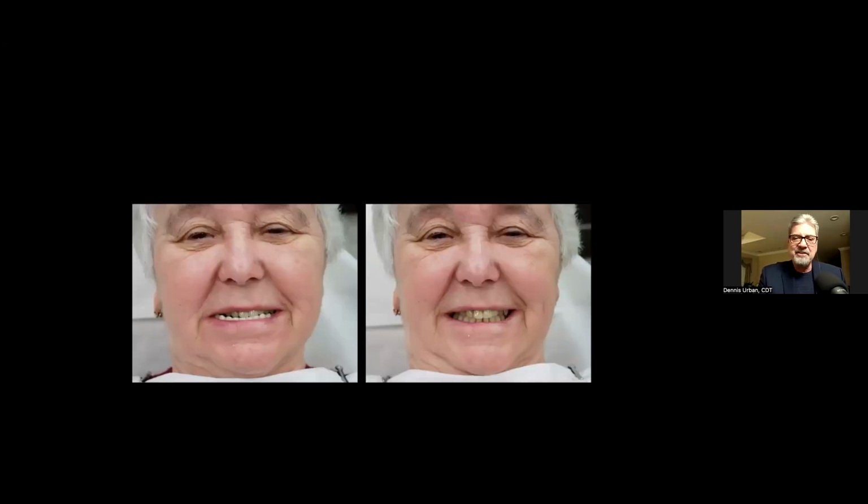So look at this patient here. This patient is ready to take an occlusal registration, and the patient is sitting back in the chair in the operatory, struggling, right? Struggling on the left-hand side to get into their physiological rest position for a correct occlusion. Finally got her in the correct occlusion, but she's still struggling. And the reason why is she's sitting back and putting her head forward, and it's affecting the whole procedure of taking an occlusal registration. So we want to make sure that the patient is in an upright position.